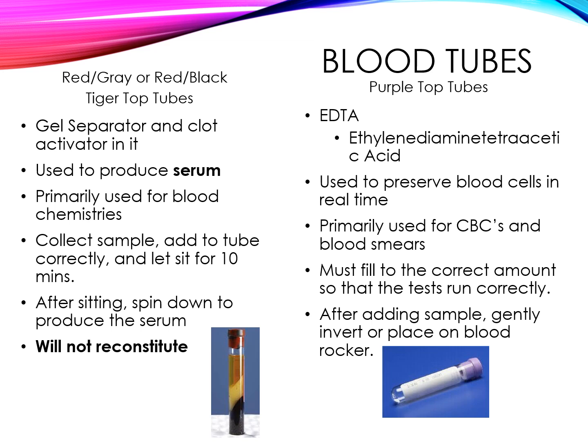It'll say SST. The serum separators will have gel in them. So the one below that is shown here has gel in the middle and clot activator in it. The clot activator in the tube will stimulate the blood to clot. And again, remember, when blood clots, it makes serum. So the fibrinogen is removed from the plasma, and outside of the clot, the leftover fluid is serum. These tubes we use in vet med for chemistries and antibody testings and lots of other things.